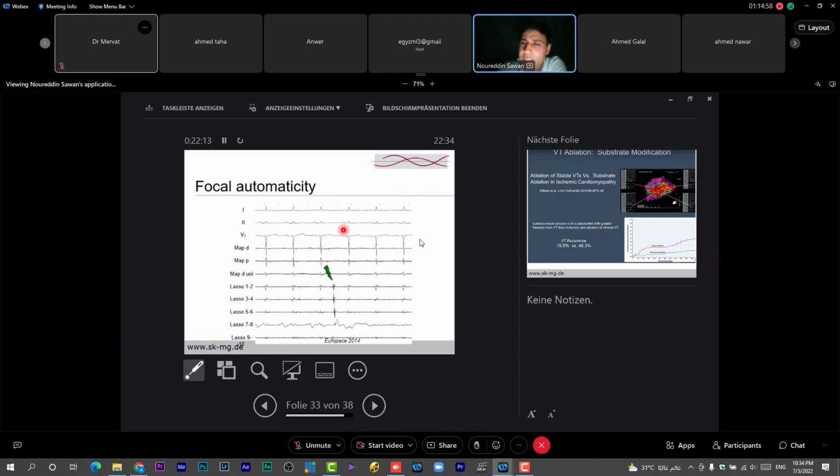In this case, it was not that difficult because the tissue in the aneurysm area was thin, but normally to isolate ventricular myocardium is very, very difficult. I would not advise to do that as a standard, maybe in selected cases like this case, but not as a standard.